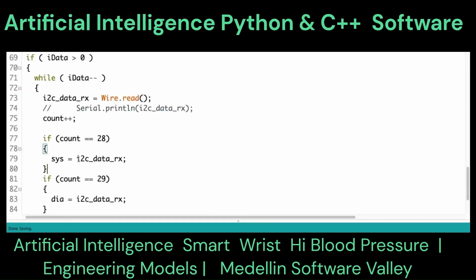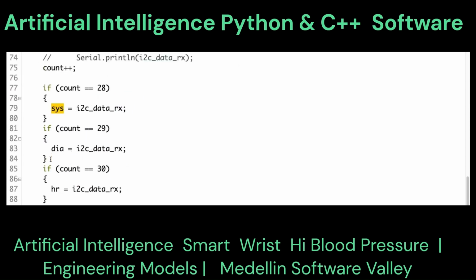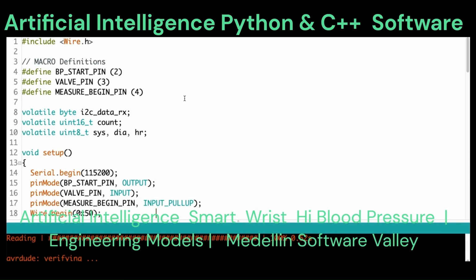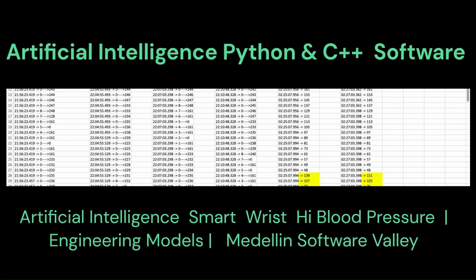These are different functions which also form part of the software methodology. Then within the script, check if the measurement is completed. The CPU will get the data from the monitor display unit. That is part of the software environment.